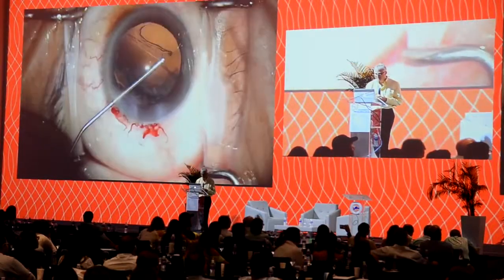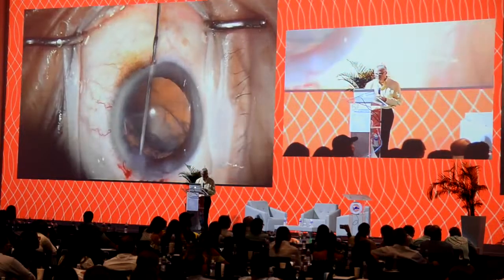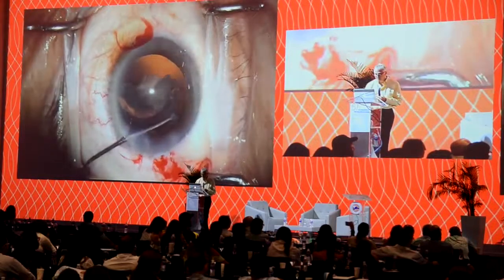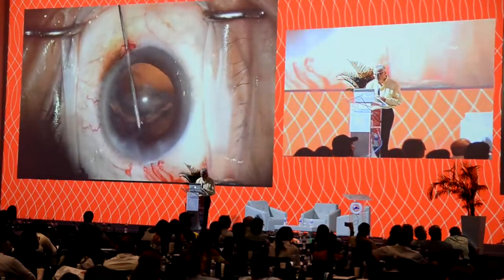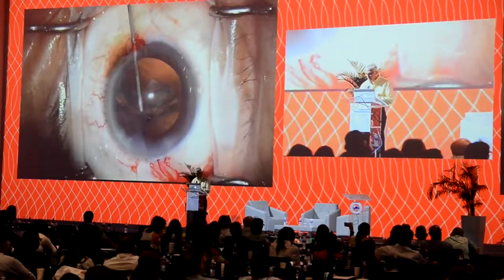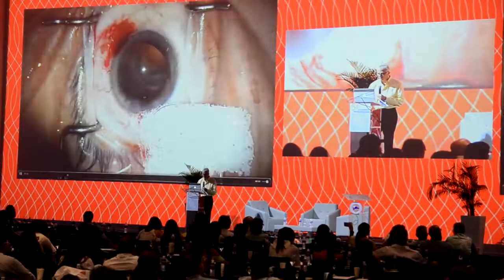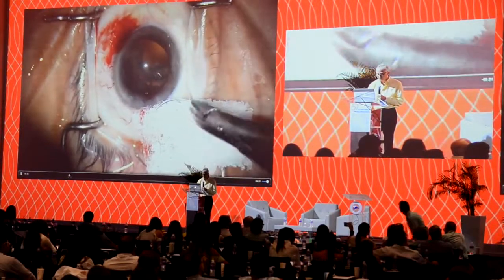This is not a vitrectomized eye. The vitreous is still in the eye. Now, we're going to use Bob Osher's dry aspiration technique to remove the residual cortical material. And while it might be a little bit tedious, we just use a 27 gauge cannula on a 3 cc syringe, half filled with BSS, and we gently aspirate the soft peripheral cortical material, adding additional OVD as we go.